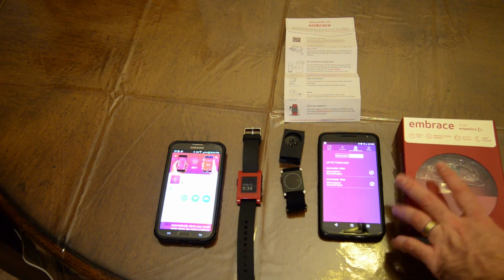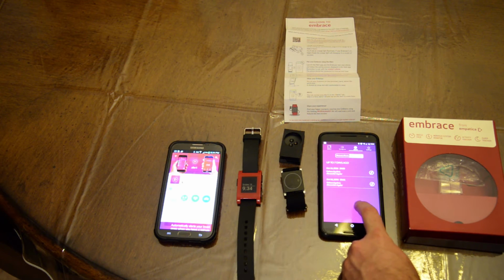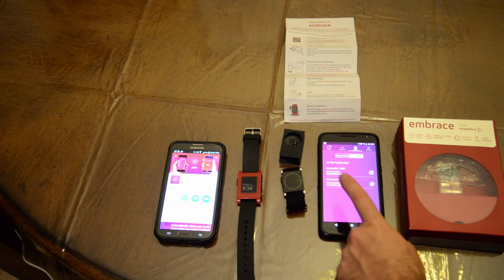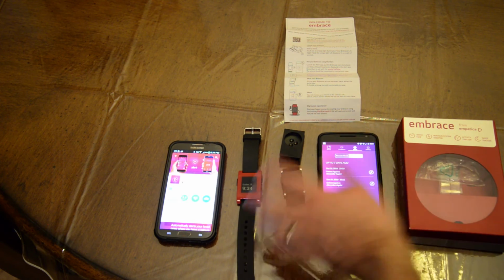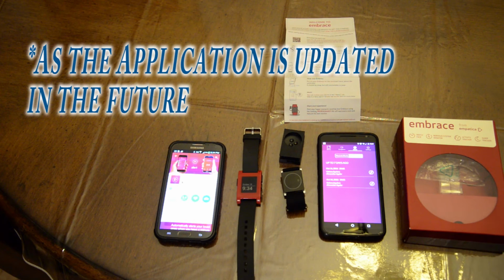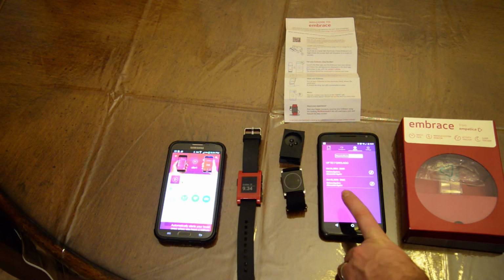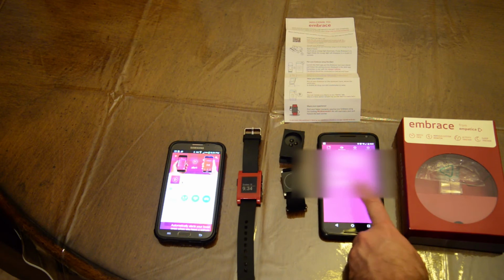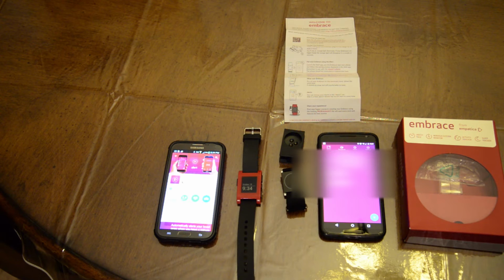This is pretty interesting, because what ends up happening is we could get my son a cell phone with, I guess we would have to get cellular data or some kind of wireless internet connection at his school, and we will be able to track his seizures while we're at work and he's at school. As this device gets smarter and smarter, we should be able to designate more alerts that would be more accurate, and we could call the teacher to see if he had an actual seizure, and vice versa. The only problem is you'd want to disable the teacher's alert during the off times. You don't want the teacher to get a phone call in the middle of the night on a weekend, right?